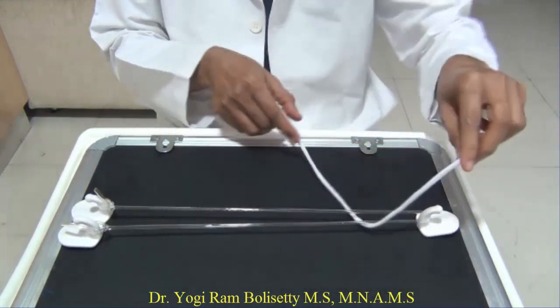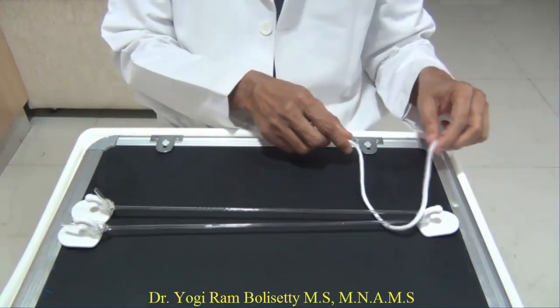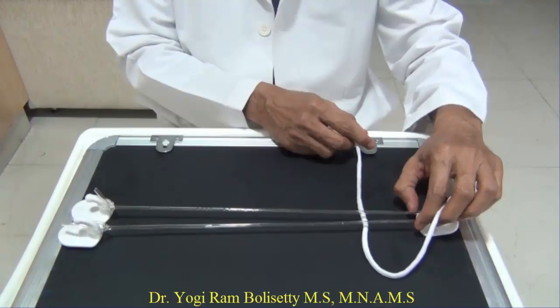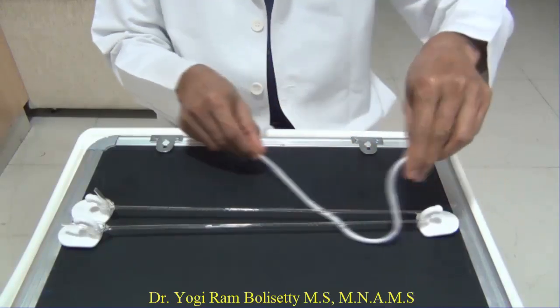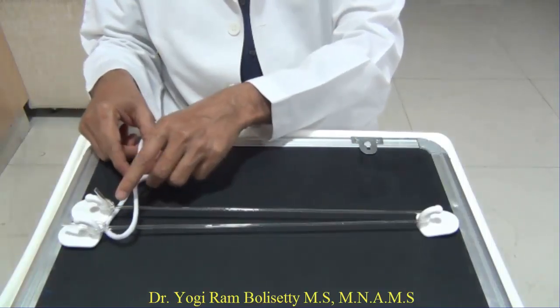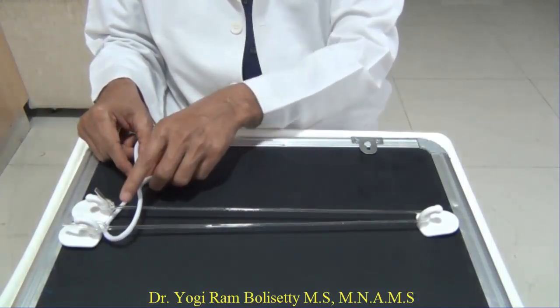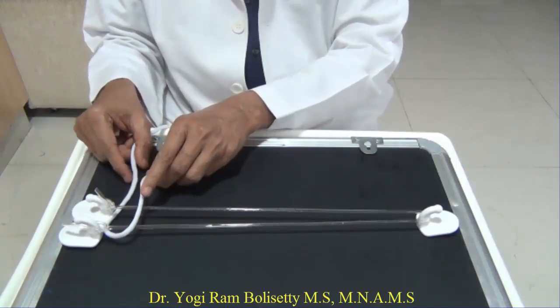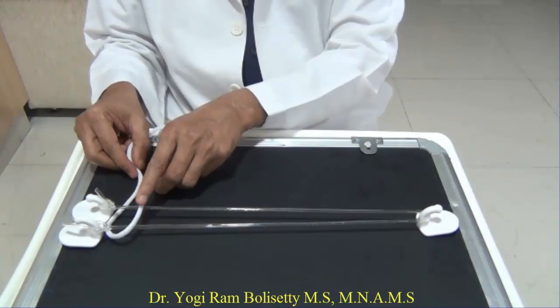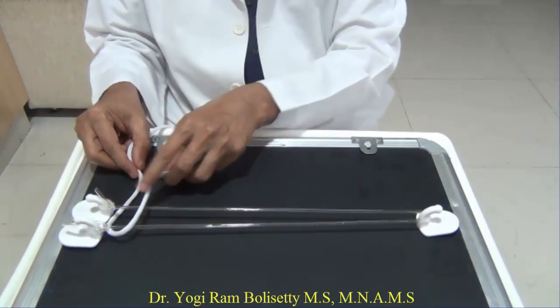First, start practicing the knot forming at this end, where the 2 tubes are close to one another. Later, you try to practice the knot making at the farther end of the tubes, where they are quite apart. That means if you make the knots here, you are making the knot under tension. So you have to practice that.